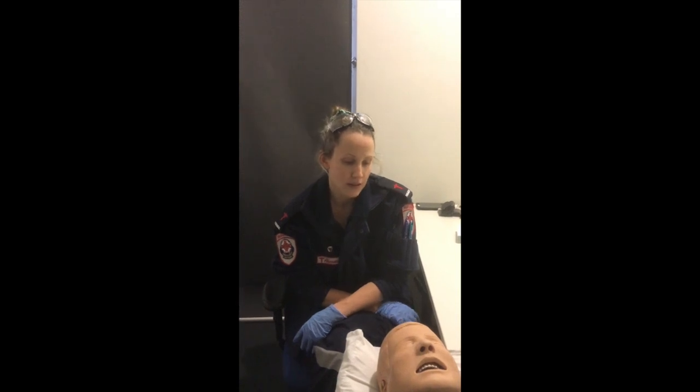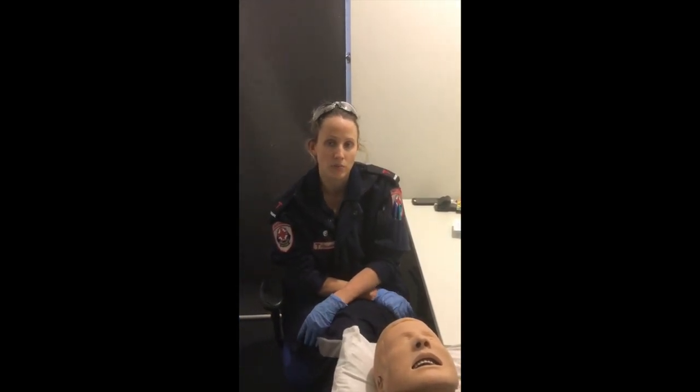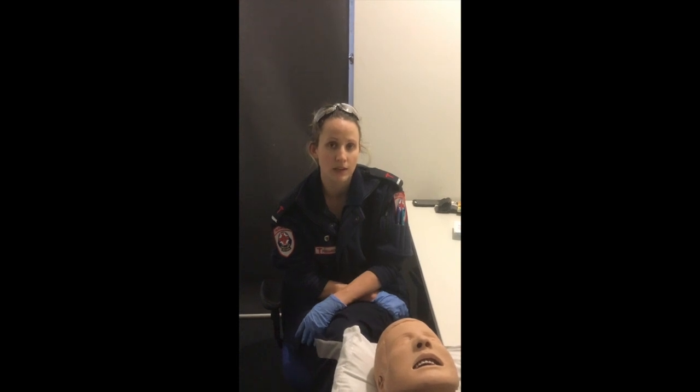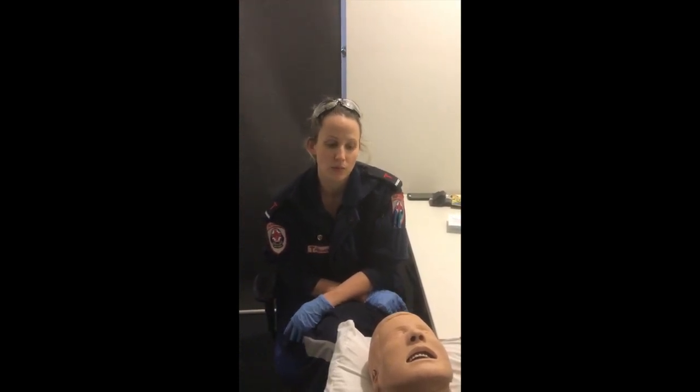So in the setting of your failed airway, some of the strategies you would ideally aim to go for in terms of your algorithm would be initially to attempt an endotracheal intubation. So this might be with a stylet or a bougie initially.